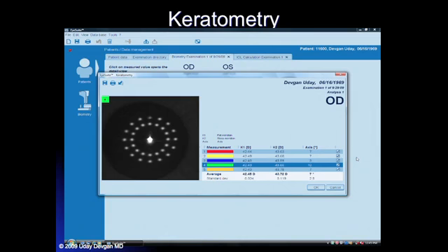The benefit from this is particularly important in patients with post-refractive eyes, post-LASIK eyes, post-RK eyes, and unfortunately in my practice, that's 40% of my IOL volume is post-LASIK, post-refractive. It's part of the neighborhood in which I practice. Everyone's had LASIK. And so this is an important measurement for me to get more accurate Ks.